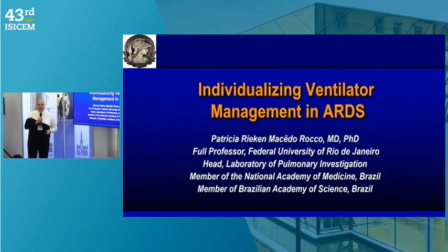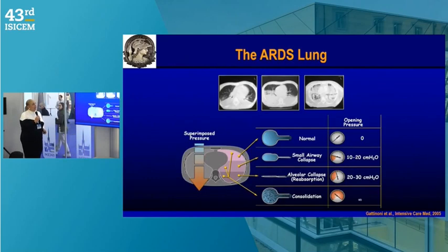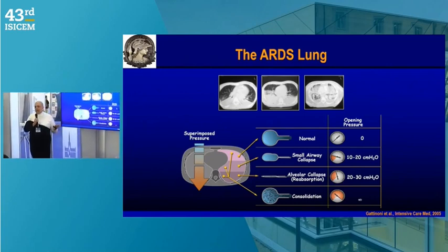So our demo is entitled Individualizing Ventilator Management in ARDS. My name is Patricia Rocco. I'm a full professor at Federal University of Rio de Janeiro in Brazil. And this is our challenge, to ventilate a patient with ARDS. Imagine ventilating a patient where we have areas of consolidation, areas of alveolar collapse, small airway collapse, or normal areas. It's a huge challenge.